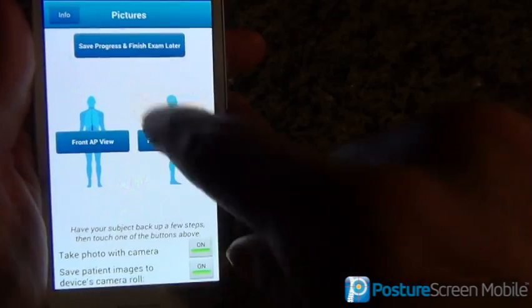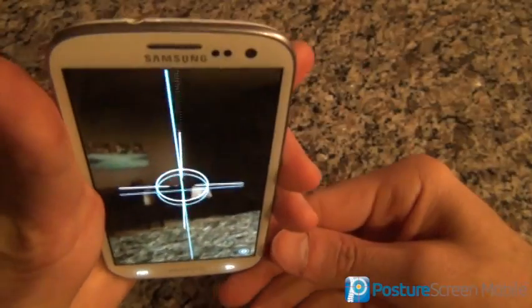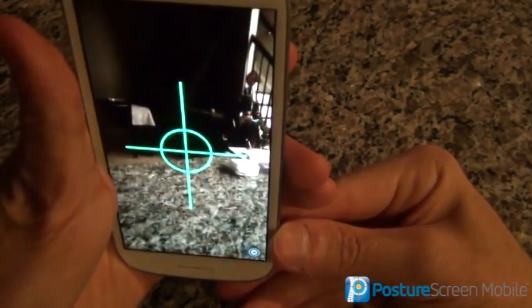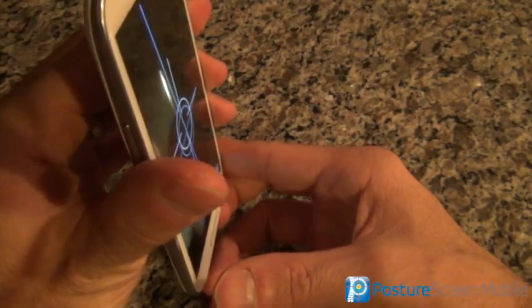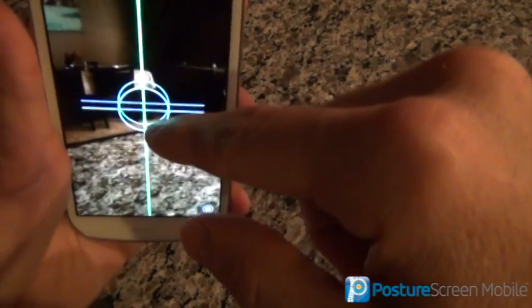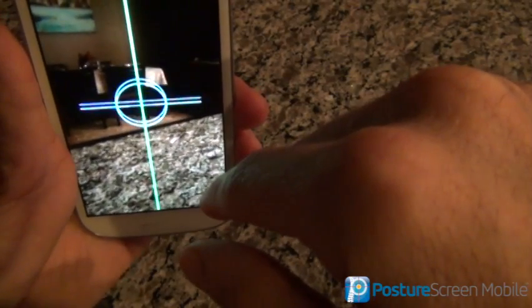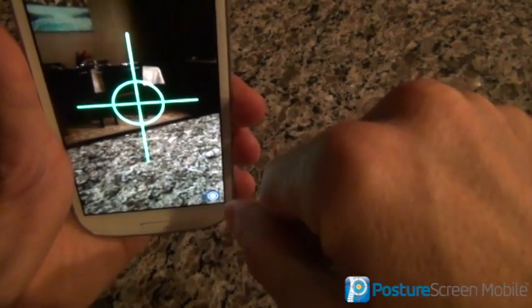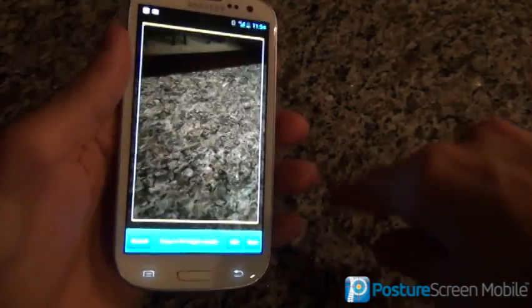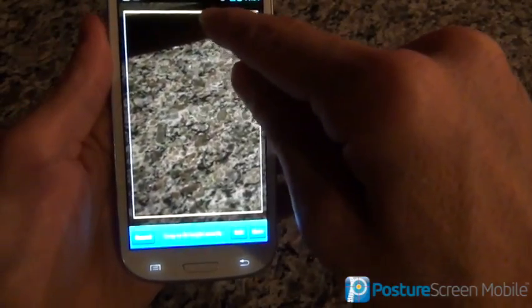There are two ways to pull photos in. Number one, we can take a photo — click here and the camera is already on, giving you this heads-up display. Even though I don't have a patient in front of me, I have it set on 15 degrees for the horizontal, so it will line up and turn green. At minimum, you want to get this vertical line straight when taking a photo. Then you can snap the picture. You take a snapshot and pan and zoom so the top of the head gets to the yellow line and the bottom of the feet gets there.